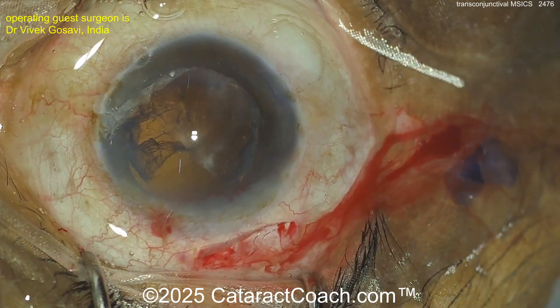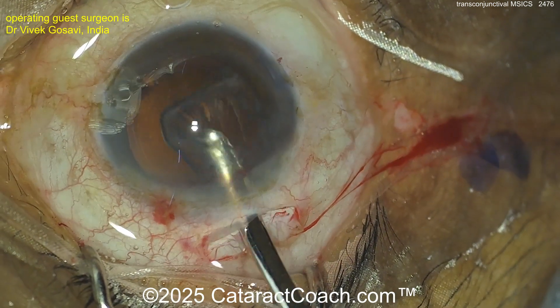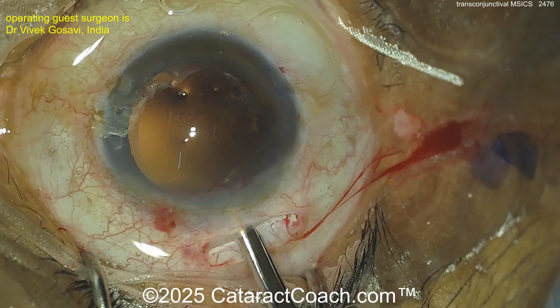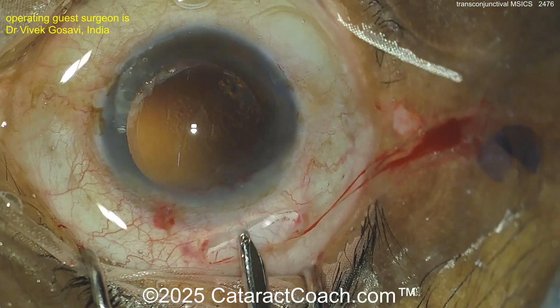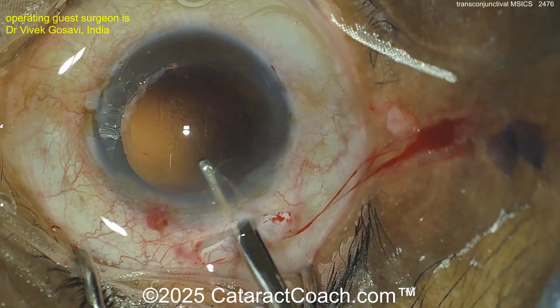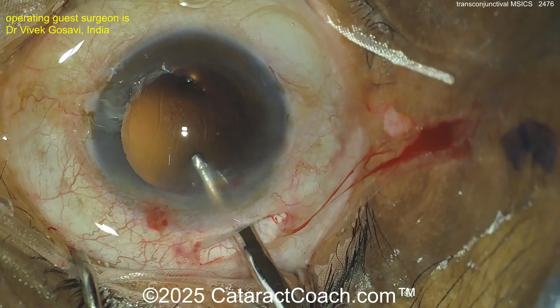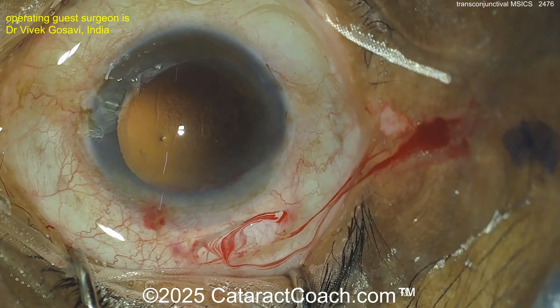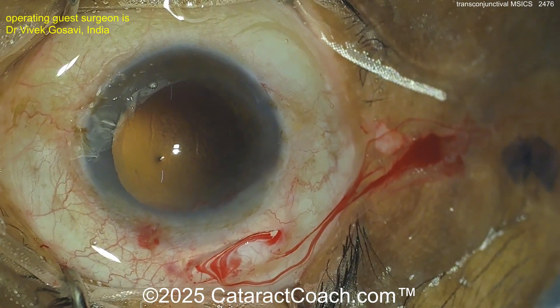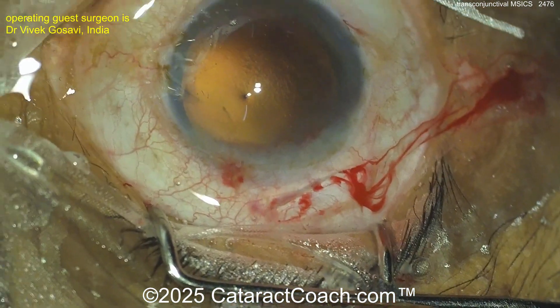A little bit more cleaning from the main incision now, and then with the lens — it's very easy to put in a single-piece PMMA lens if you'd like. If you want to keep costs really low, in other parts of the world PMMA lenses are much less expensive than foldable lenses. Here cleaning up the capsule bag very nicely — the PMMA lens can just go right in. Remember, PMMA is polymethylmethacrylate — rigid lenses that you cannot fold or cut.